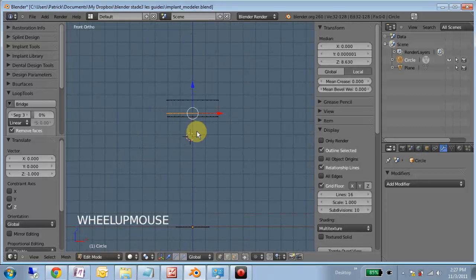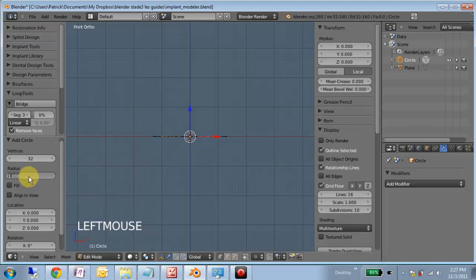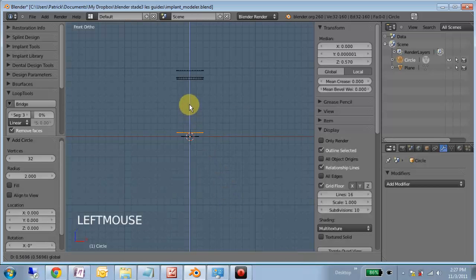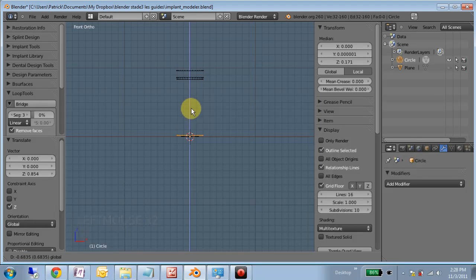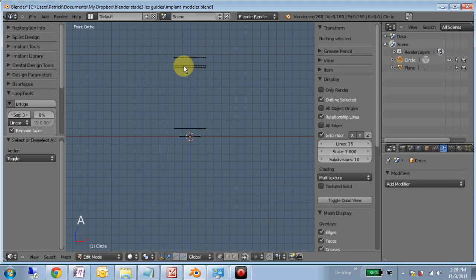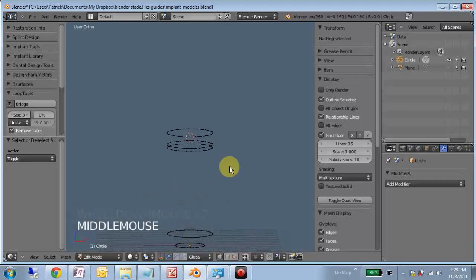Now the final thing we might want to do, center our cursor, add a circle, 4 millimeters in diameter, and then while this implant is parallel-sided, it does taper here at the end. So we may want to just pull this up here to establish that taper. I don't know what exactly it would be, but I'm going to guess 1 millimeter. Okay. So now we have all of our reference planes planned as a circle.